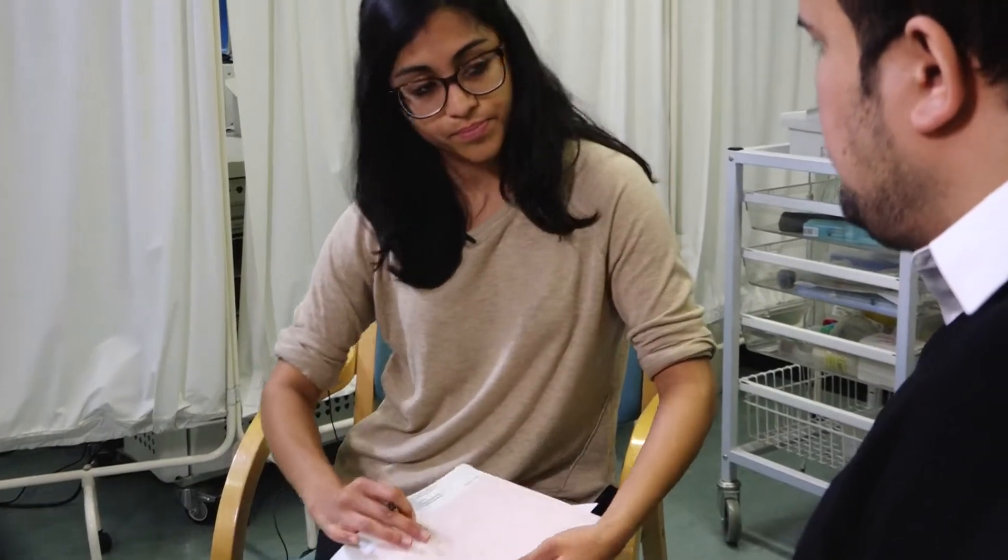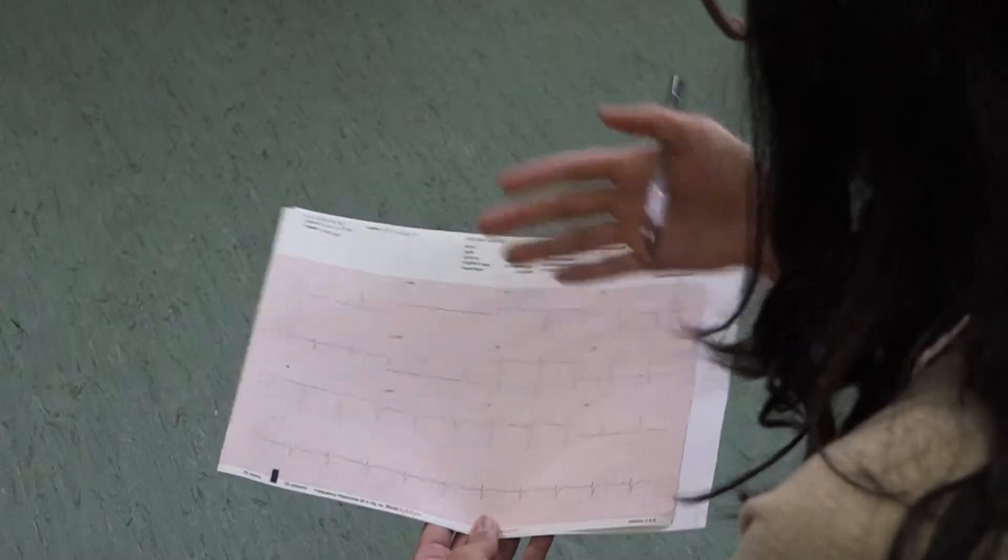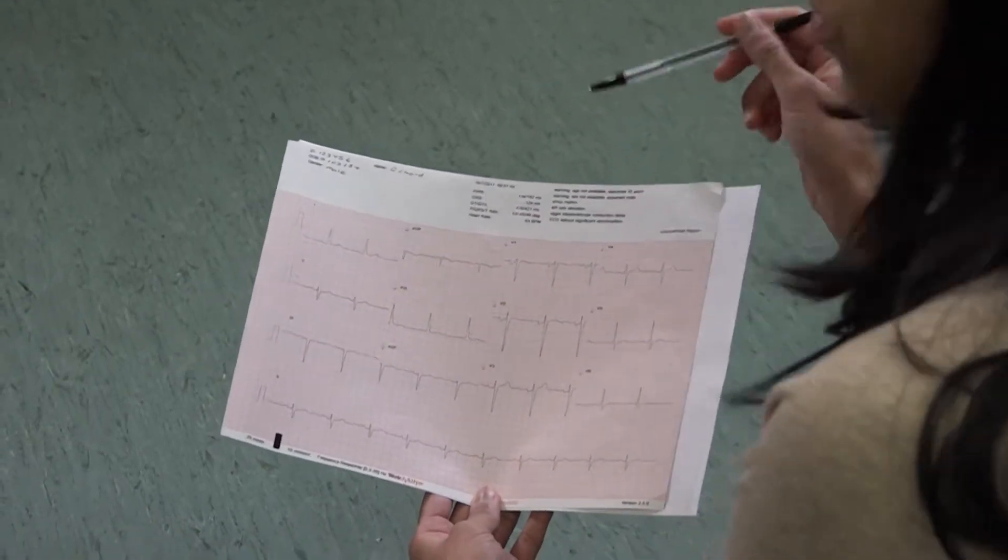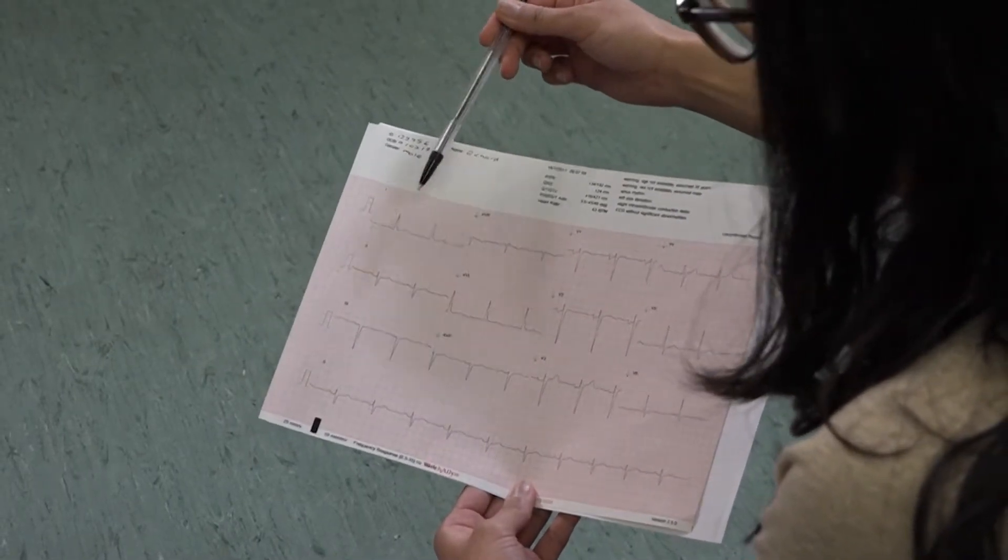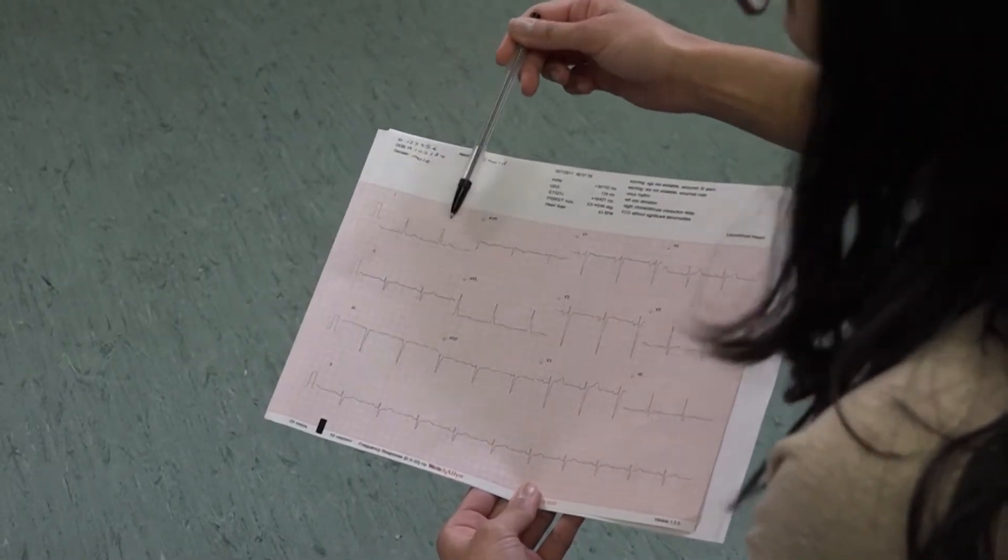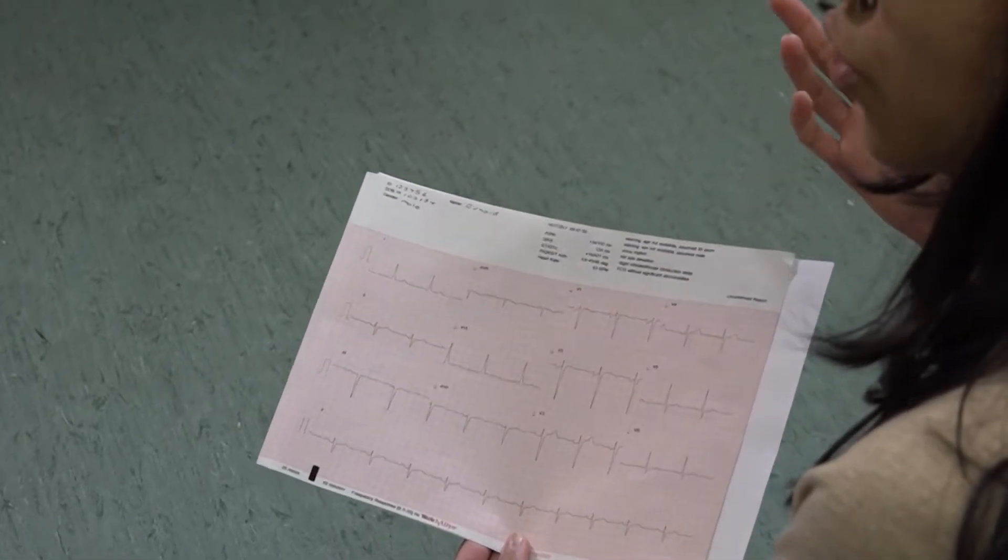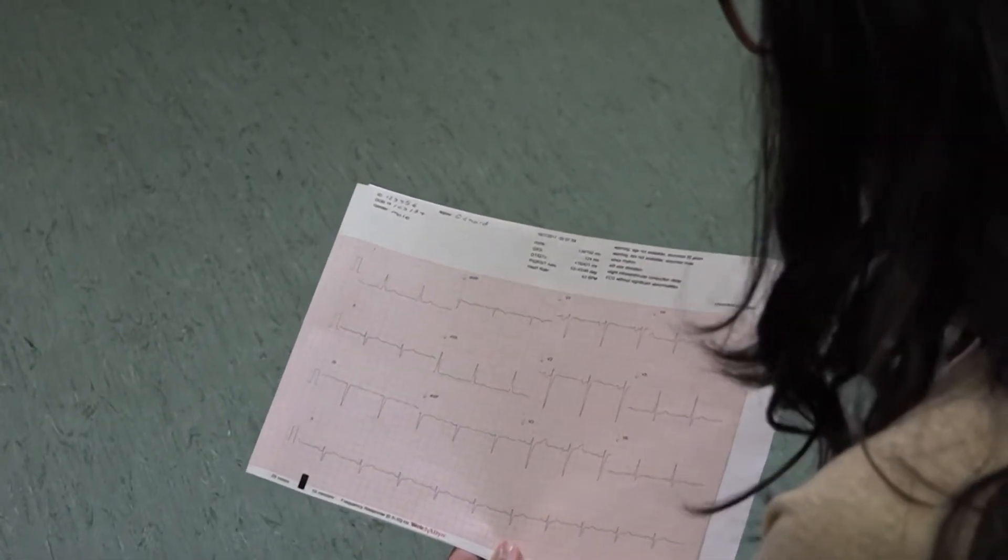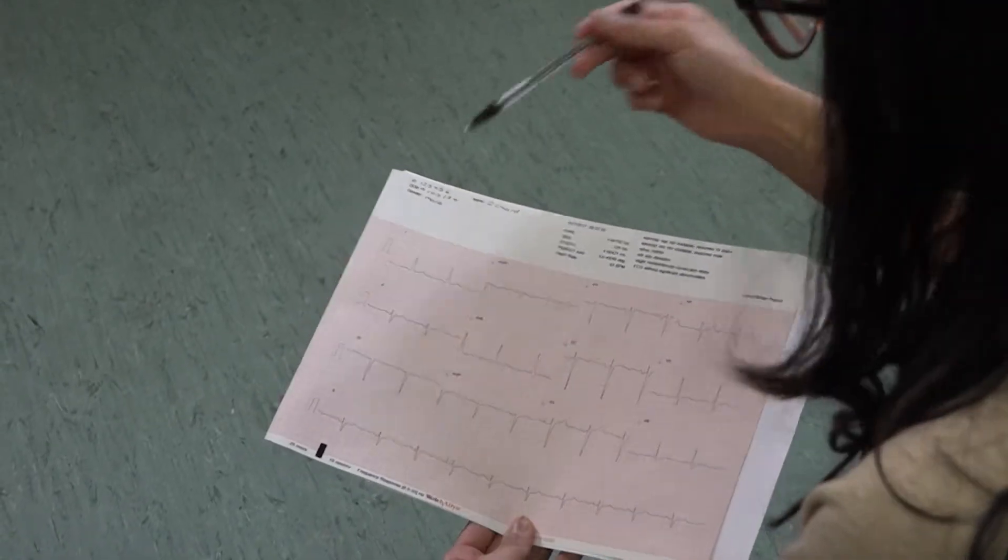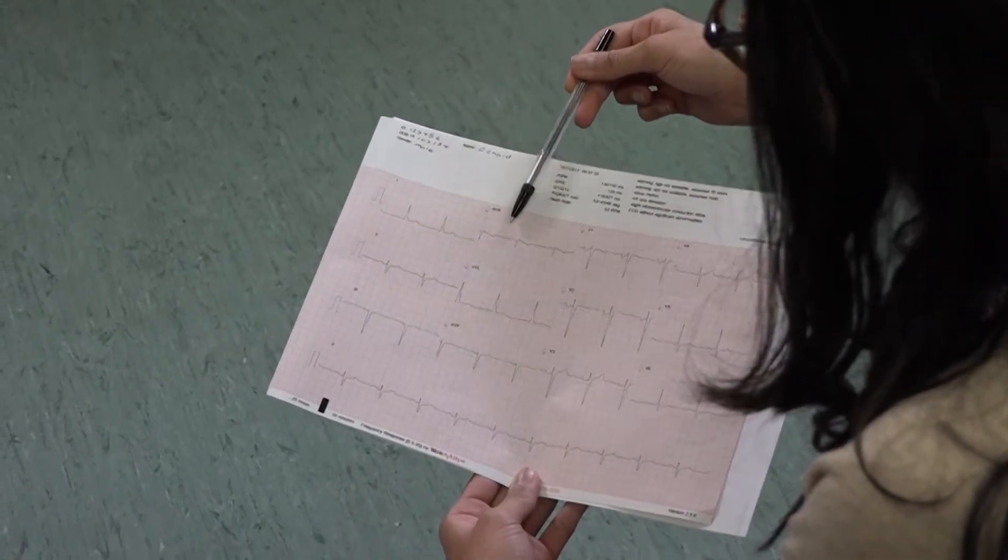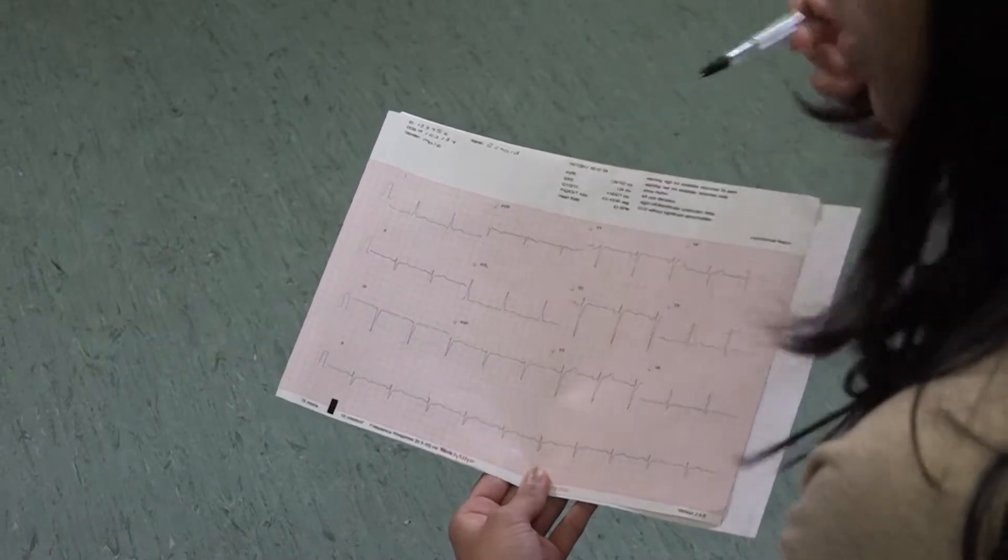And how would you determine the rate of the ECG? If your ECG is regular, the best way is to count the number of big squares between the QRS complexes and then divide 300 by that number. If your rhythm is irregular, the best way to do it is to count the number of QRS complexes on your ECG and then times that number by six.